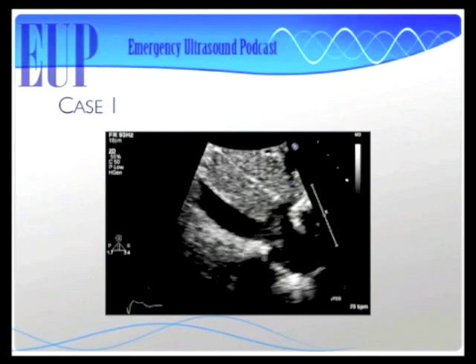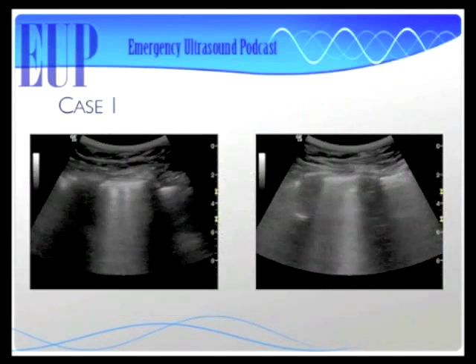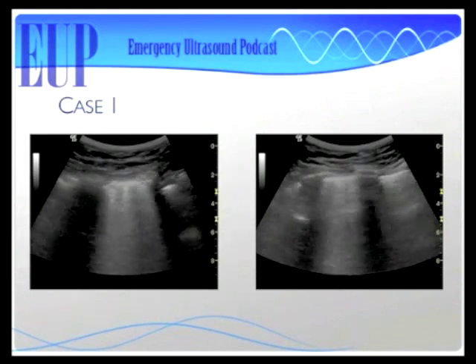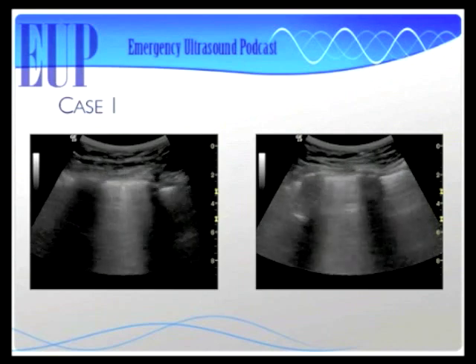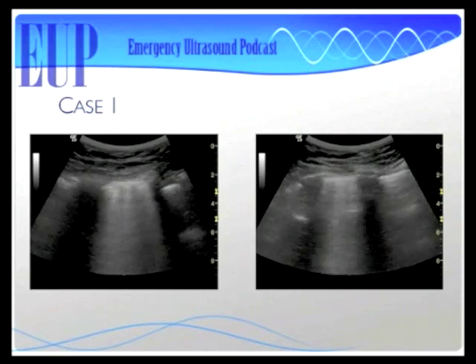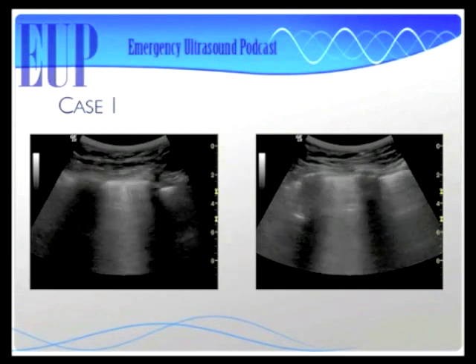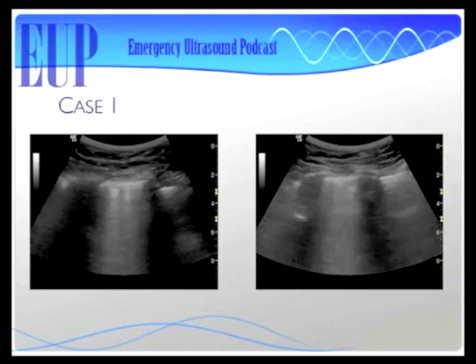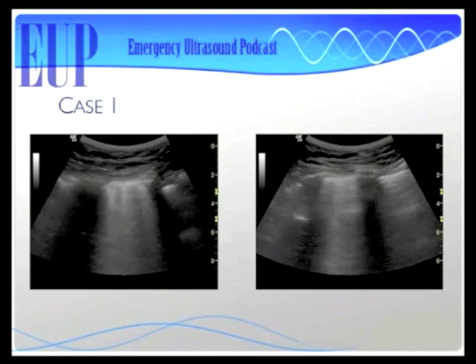And then we take a quick look at the lungs to make sure they have some movement. I want to make sure they don't have a pneumothorax. And what do I see there? Looks like some shimmering, so no pneumothorax. Right. A lot of the B lines, I guess I would want to know where on the chest you were. Yeah, so I'm anterior on the chest in the upper lung fields. So you told me that means there's a lot of fluid in the lungs. Right. So they have a poor squeezing heart, a big dilated IVC, and lots of fluid in the lungs.